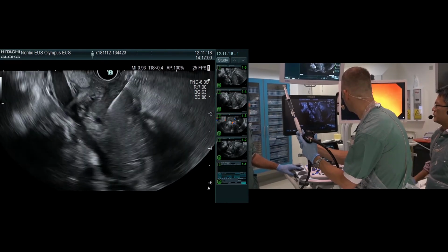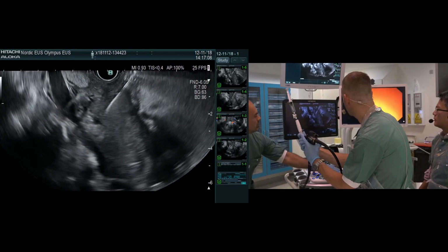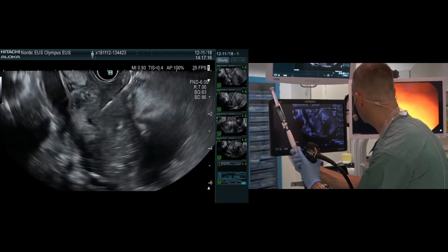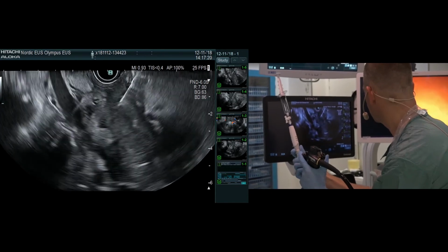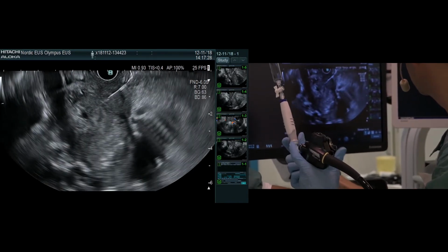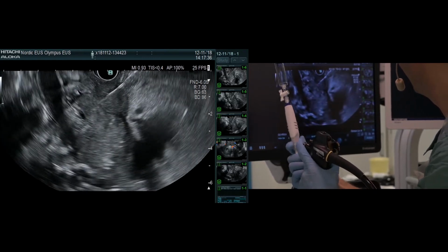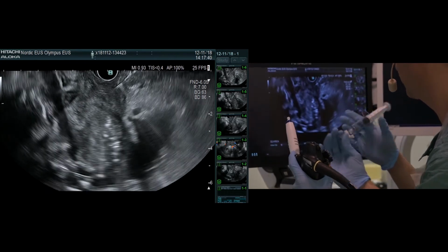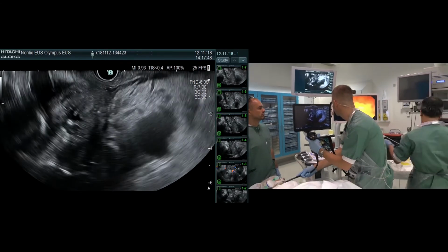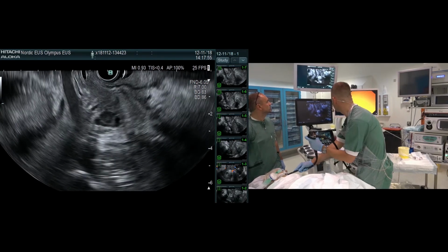I hope this time we are in the cancer. I think the first time I'm not sure, so I'm trying to cover the lesion. I'm not really used to working with this histology system, so therefore having little difficulties really distinguishing different tissue. So hopefully this is the cancer. And so I would go for ERCP first. Any disagreement? Yeah, the patient also has ascites, so I think that's one of the problems with the EUS bile duct drainage as well. But we have one more question from Paolo.